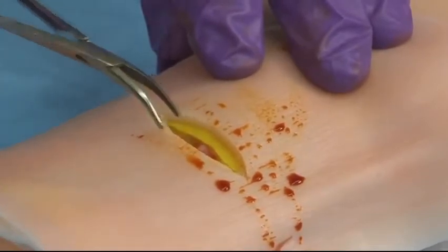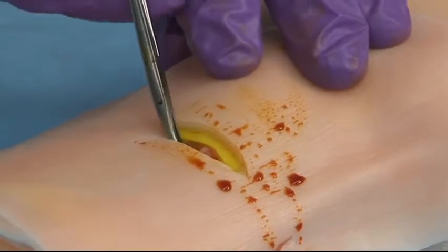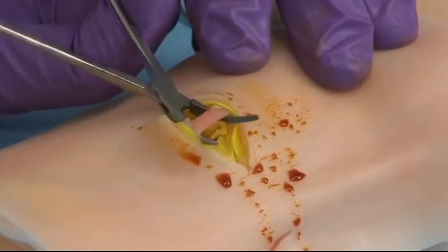Now what I'm going to do is use the mosquito clamp tips and turn them over 180 degrees, come under the vessel next to the bone, and try to hook the vessel, as you can see I've done in this picture.